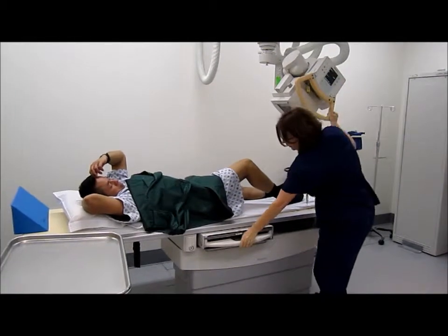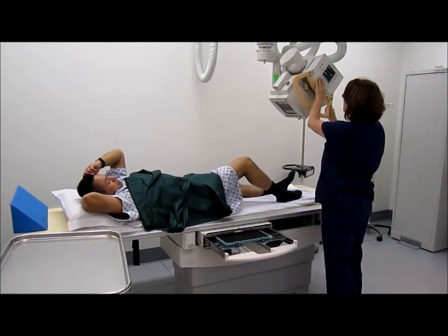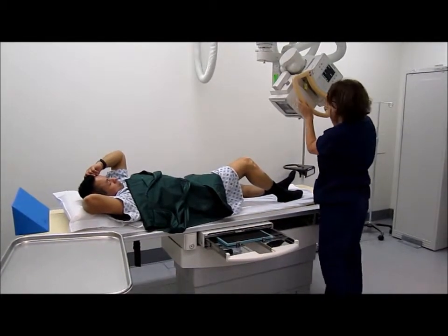I'm going to angle my tube perpendicular to your tibia. And then I need to line up the set, and back.